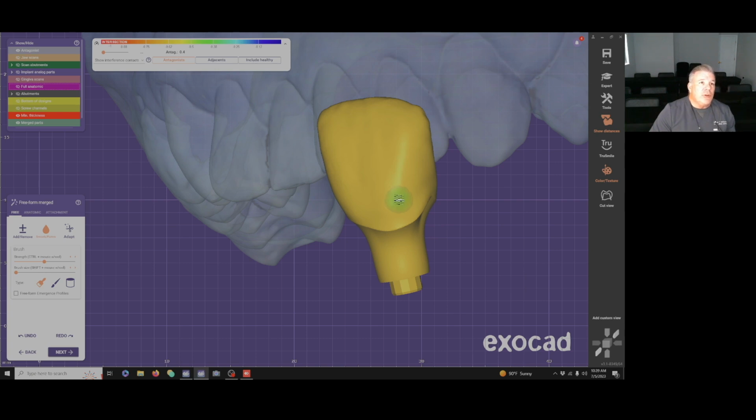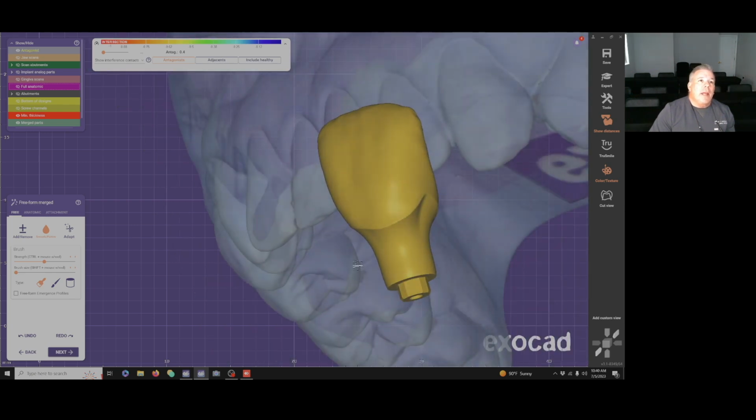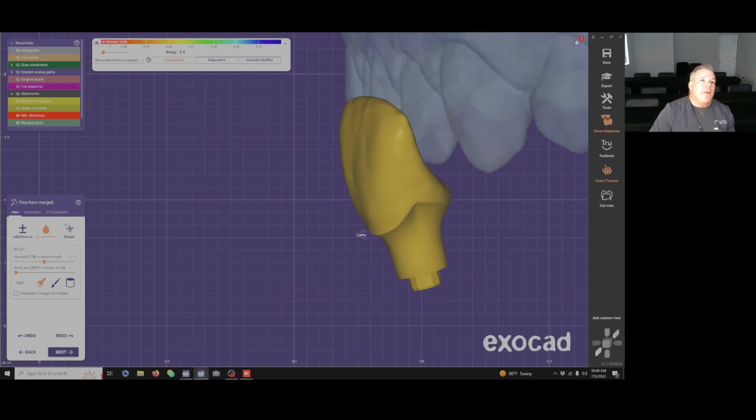It responds very nicely to it. You just have to make sure it's fully cured and nice and polished, and then we can use a screw and actually put this into the implant for the tissue to heal to this, and then later on come back with a permanent, either a metal abutment or a tie base with a zirconia abutment and a crown on top. And we're going to show you that workflow here in a few minutes. But that's one way to do it.